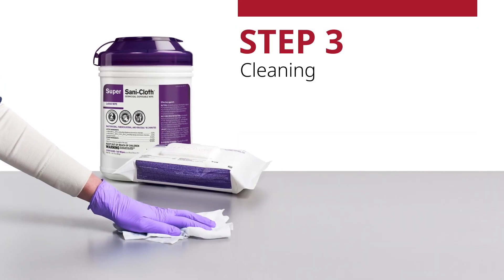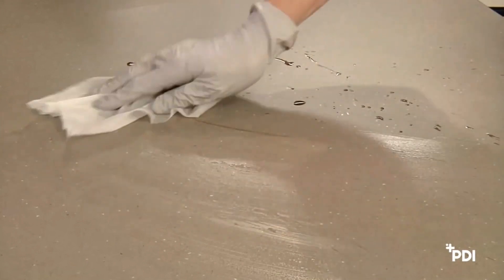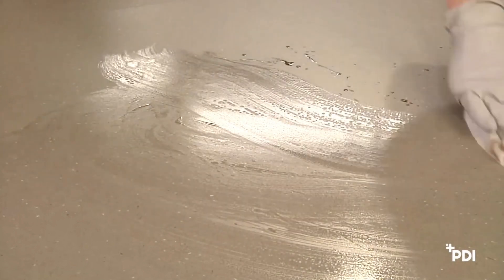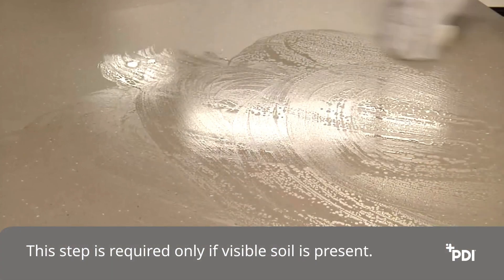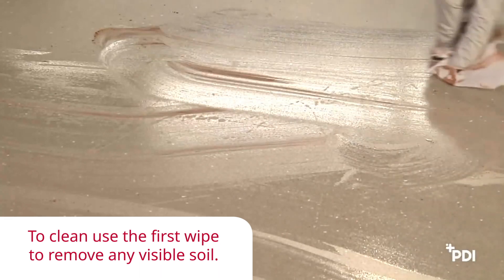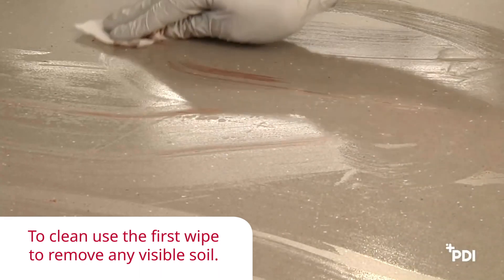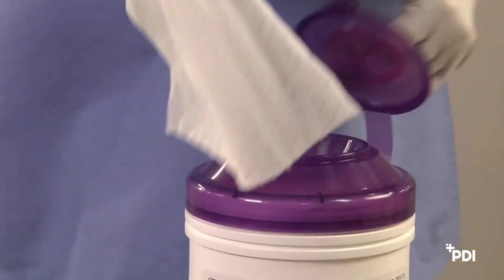Step 3: Cleaning. Before wiping a surface, determine if there is visible soil present. If you can see dust, dirt, blood, or other organic material, you will need to clean prior to disinfection. This step is required only if visible soil is present. To clean, use the first wipe to remove any visible soil from the surface. Make sure all of the soil is removed, using more wipes if necessary.